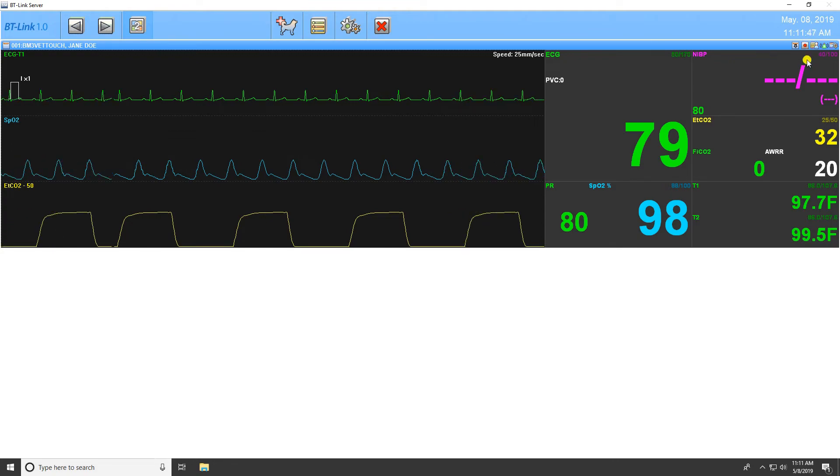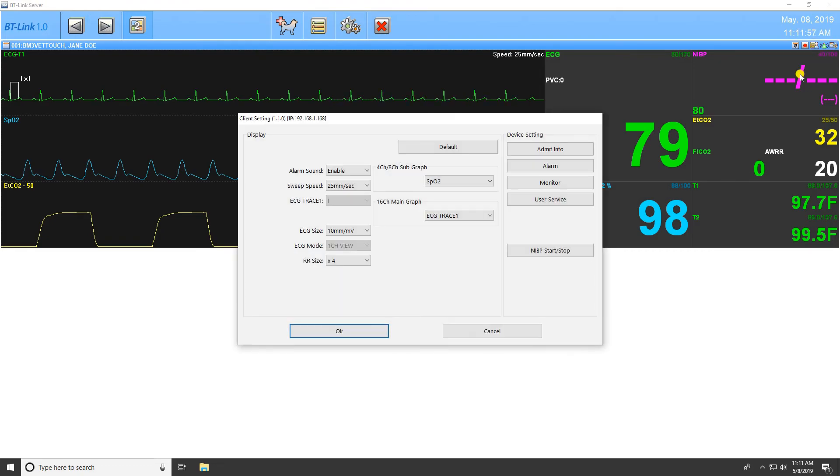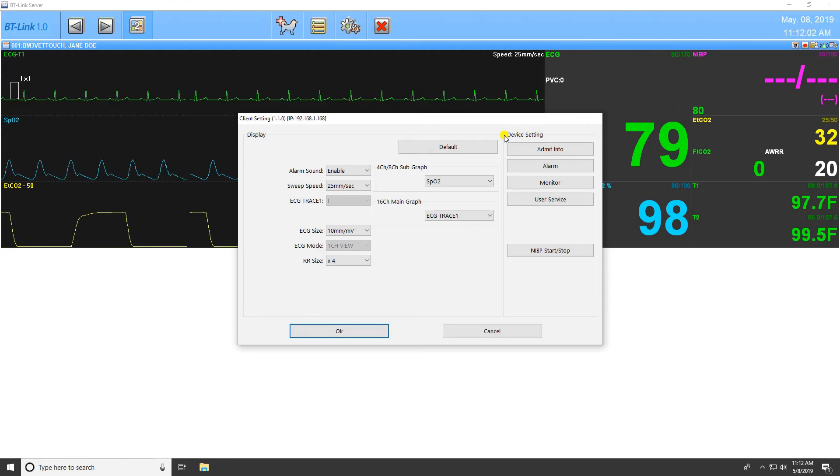The next icon is the Alarm icon, and this will enable or disable alarms for the program. The final icon is the Client Setting icon. Opening this window will allow the user to adjust the settings on the display of data within the client window. You also have the option to restore settings to default settings with the button at the top of the menu.